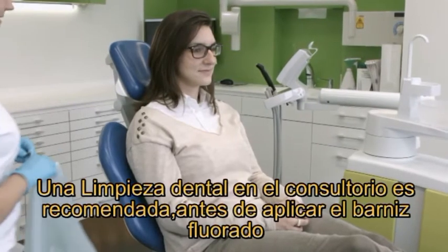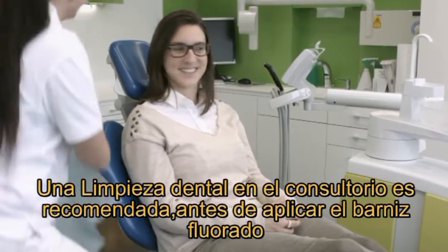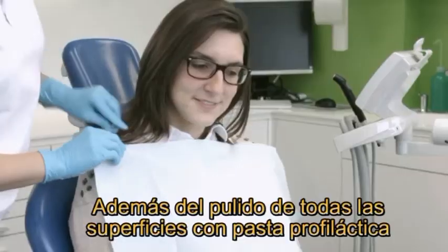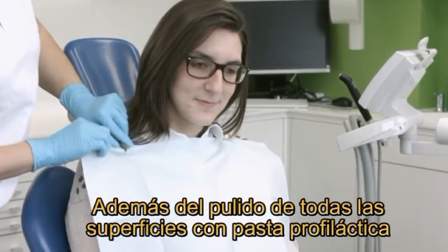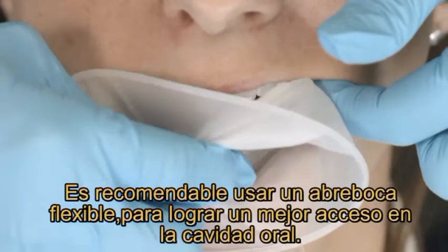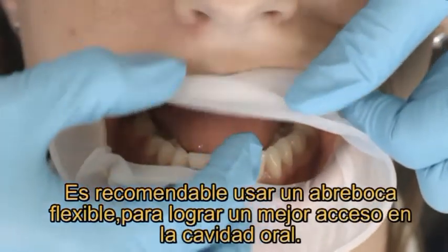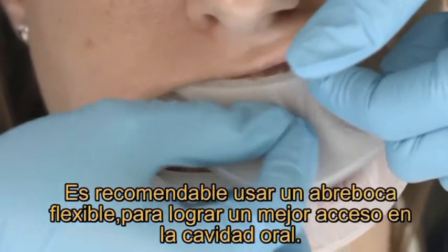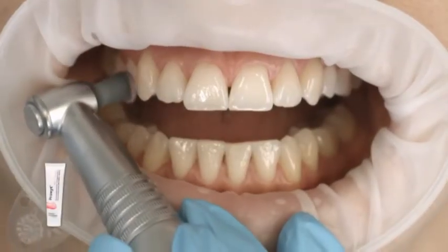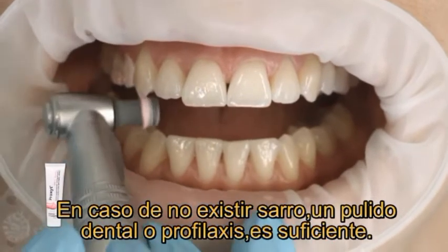Professional tooth cleaning with, for instance, Proxyt ProfiPaste is recommended before in-office application of a fluoride-containing protective varnish such as Fluor Protector S. Our tip: use a flexible lip and cheek retractor such as OptraGate. OptraGate gives you easier access to the oral cavity. Under field conditions, thorough tooth brushing will be sufficient.